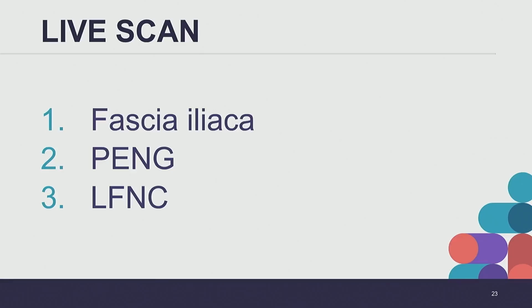We're going to start. So this is the Peng block. Dr. Burnett switched over to a curvilinear probe. And you can see, as superficial as I can go, a nice little trough here.